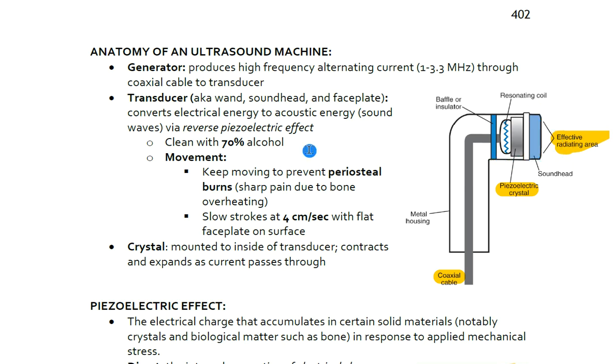We do want to clean the surface with 70% alcohol to prevent any cross-contamination of anything that may be on the patient's skin, such as bacteria, Staphylococcus aureus, or other things like that.